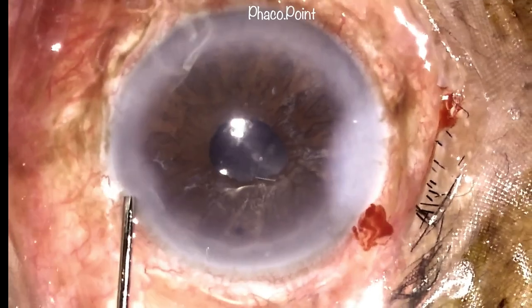an optimal end result. So, for a single vitreous strand that has prolapsed, it's quite possible to negate the need of using an entire anterior vitrectomy setup in order to cut it. A pair of intraocular scissors introduced from a point away from the area of the vitreous prolapse is almost always adequate in severing it appropriately. We now move to the second case.